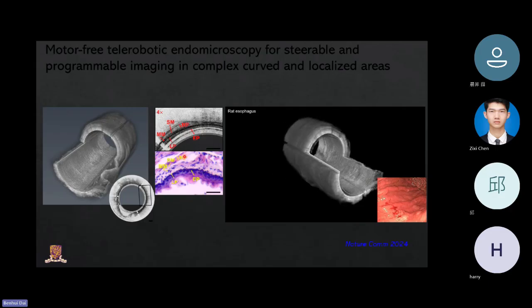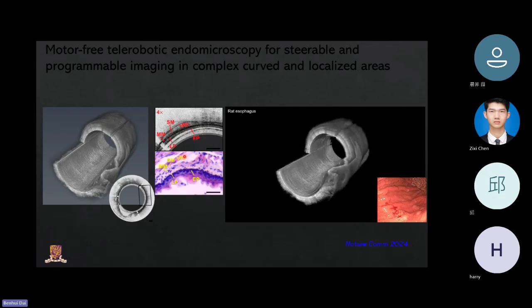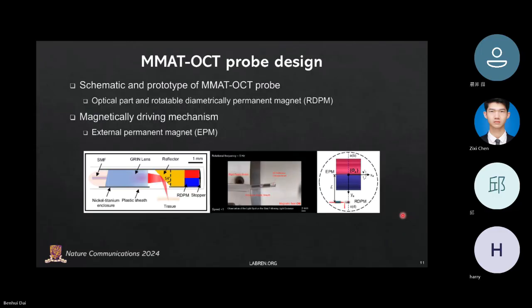By doing this, potentially in the future, we can have real-time optical biopsy to help a surgeon quickly identify the disease stage, stage 0, 1, 2, 3, 4, which is otherwise not possible from purely RGB endoscopy.